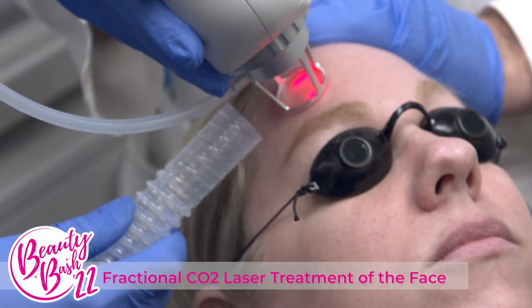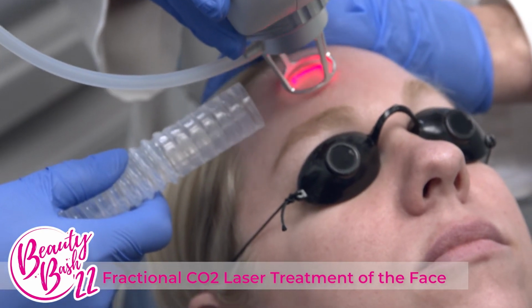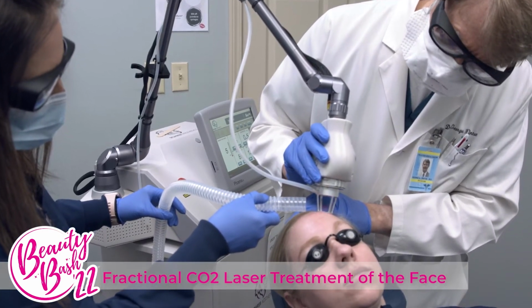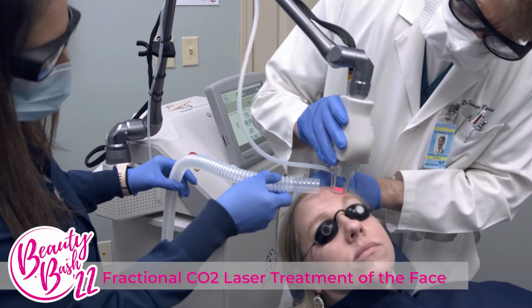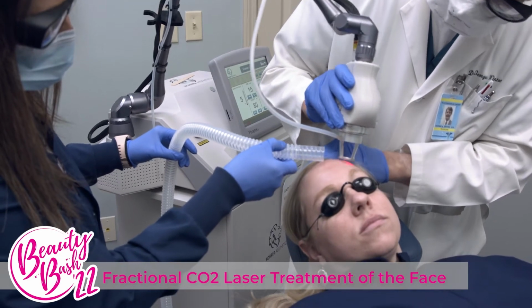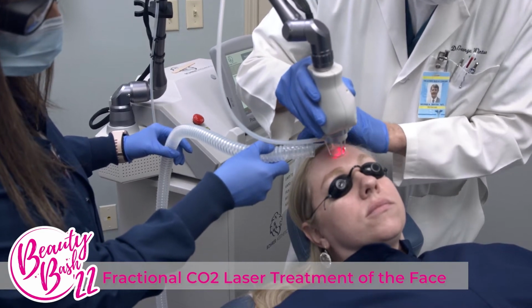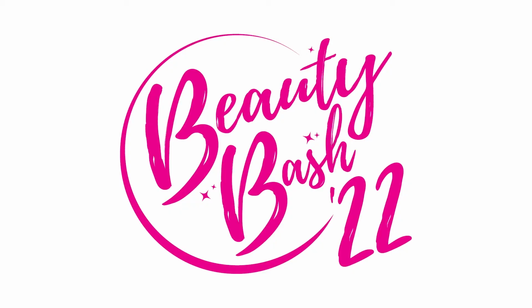Only a very small beam of energy reaches the skin in an instant, with additional pulses distributed widely around the treated area. This scattering of pulses reduces discomfort. Most treatments require only topical anesthesia, but if discomfort is a problem, cutaneous anesthetic injections can be added to sensitive areas. Fine lines, brown spots, and red spots can all be expected to improve with this treatment. If needed, more than one treatment can be done every 1 to 2 months until a satisfactory endpoint is achieved.